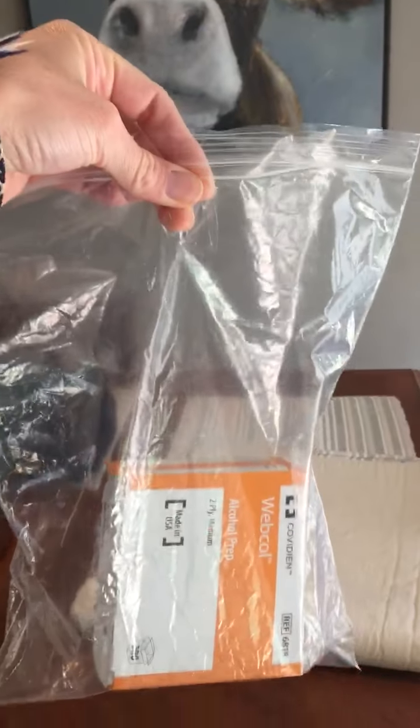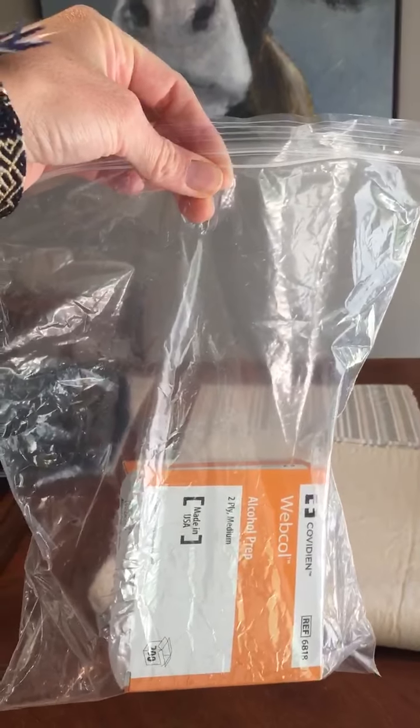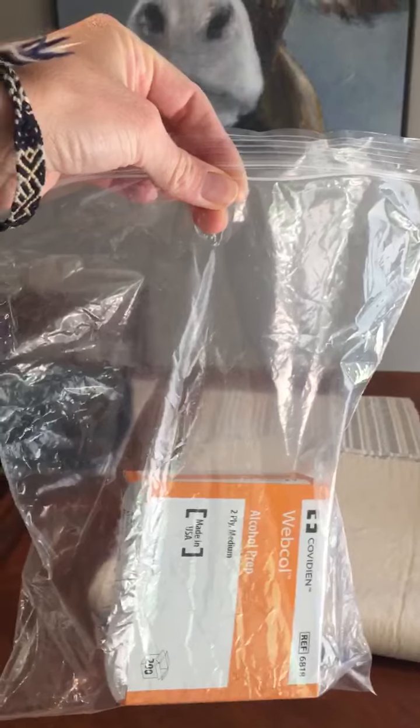That way you have a place to put your pump if you run into any issues with having no clips available or a fanny pack.